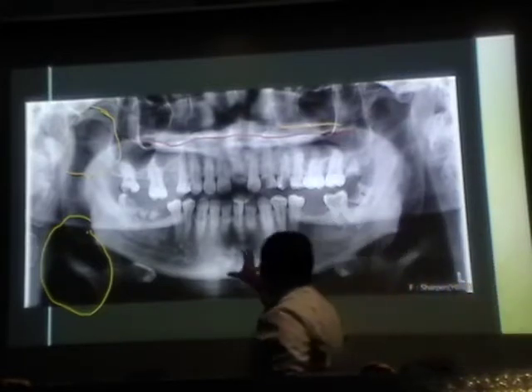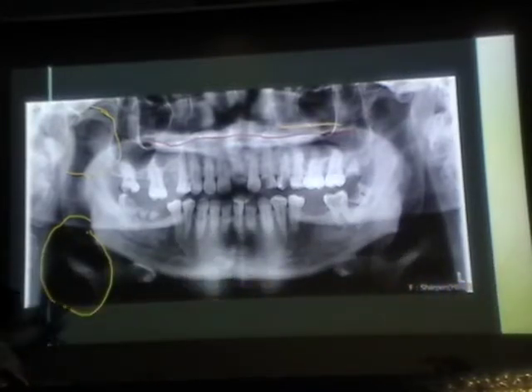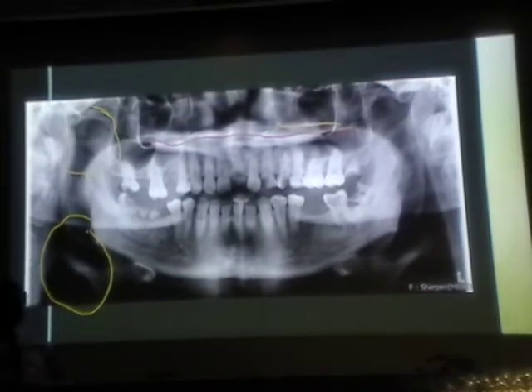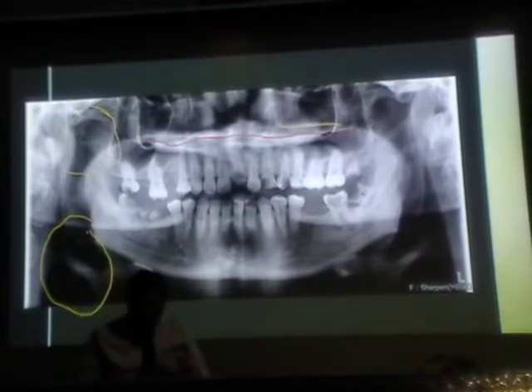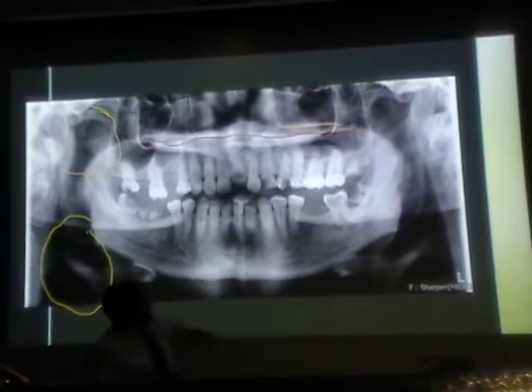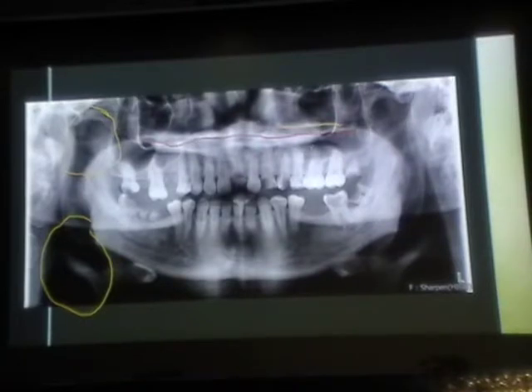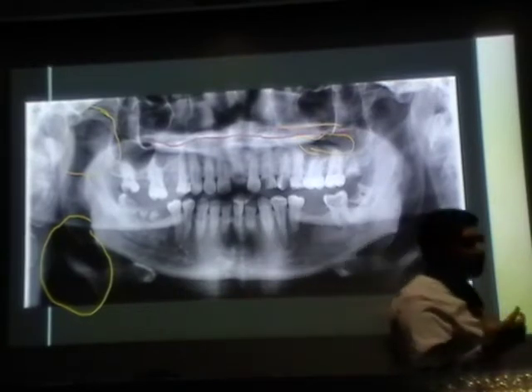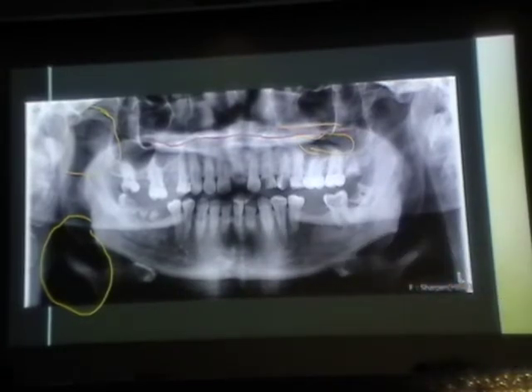And in that, if you look at the spaces here, okay? Now the space here is between the tongue and the pharynx, right? So what do you combine together? Airspace, okay. That's good. And what is this space called? This little tiny teeny thing. It's between palate and tongue. Palatoglossal airspace. Yes, Josh.